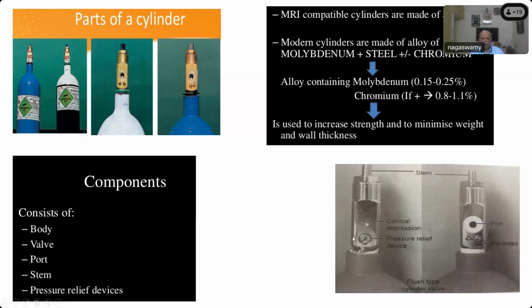And this is the pressure relief device. And there is something called Wood's metal. Where will it be? Another favorite question in the examination: What is Wood's metal? Where is it present and what is it made up of?